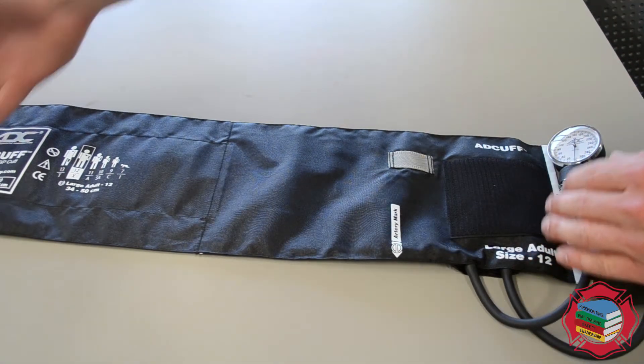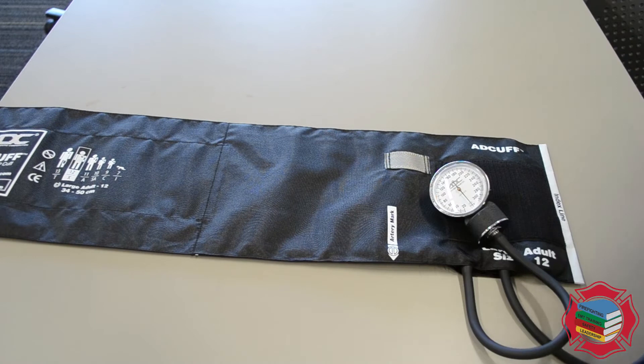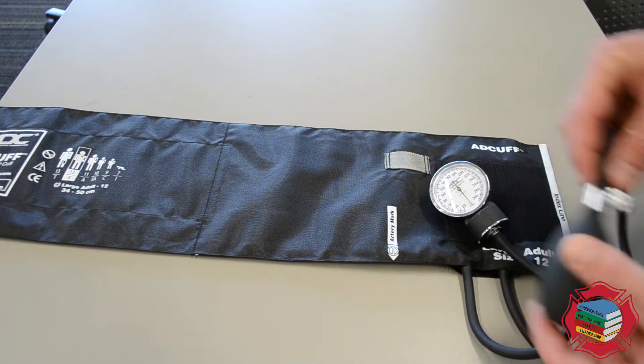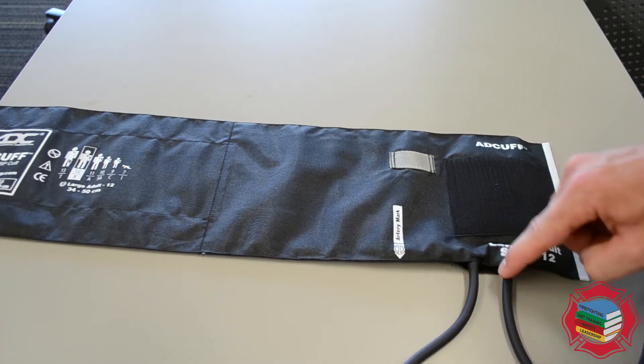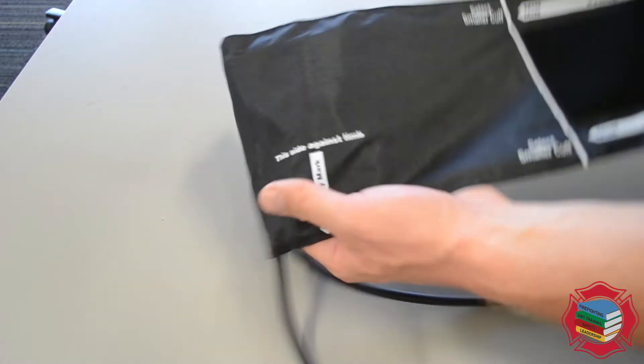The blood pressure cuff is this entire component right here. This is the sphygmomanometer. This is the bulb that allows us to inflate the bladder. Where these two hoses connect there's a bladder housed inside, and this is what wraps around the arm.